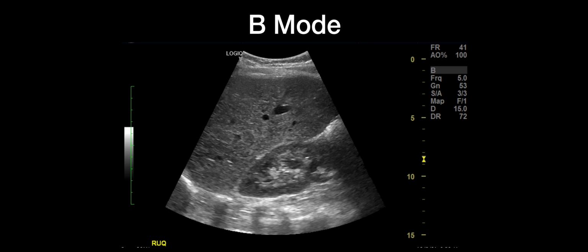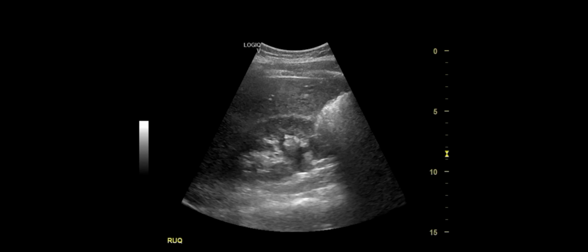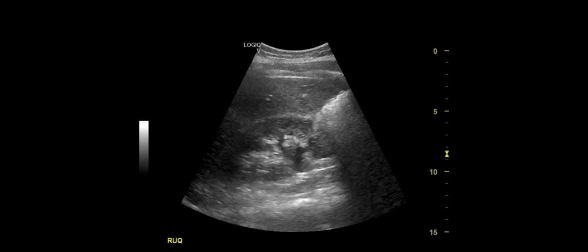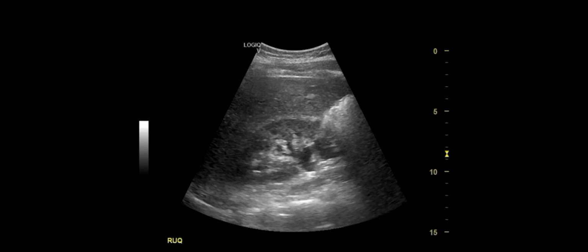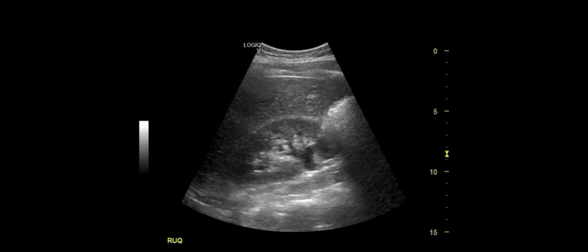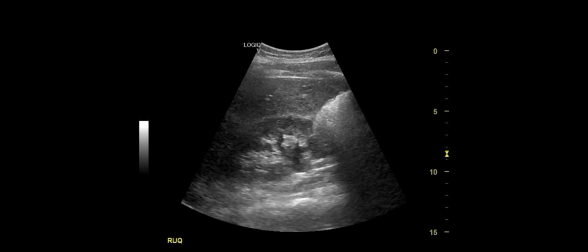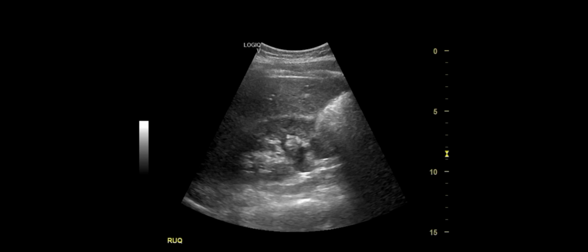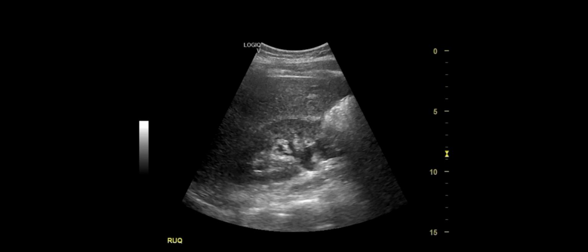But even better than that, it doesn't create just a static picture. When we're looking at ultrasound, it's a real-time moving image. So it'll refresh every so often. And so what you'll actually be able to see is not only liver and kidney, and in this circumstance, we're seeing that little bit of hydronephrosis in around here in the kidney. We'll be able to see that move as the patient breathes. So it's a much more dynamic assessment of what's happening in your patients than some static image that you would otherwise get with chest x-rays or CT.